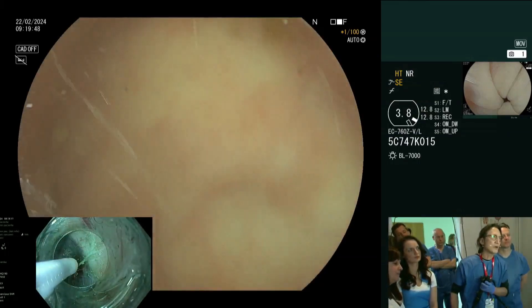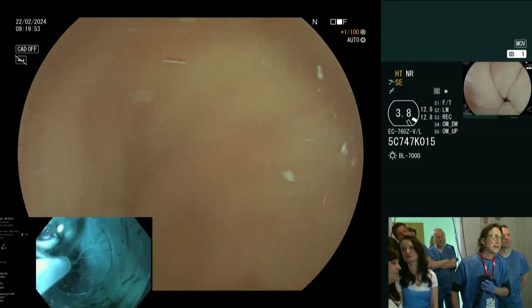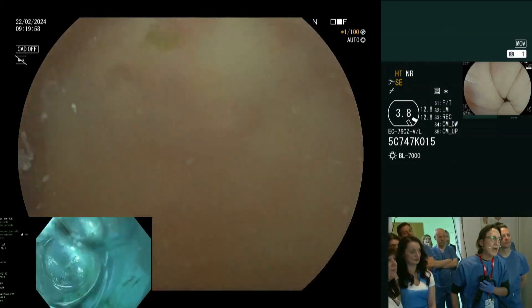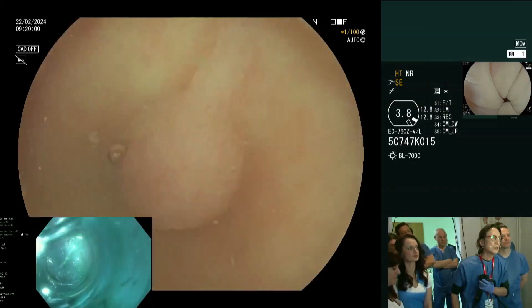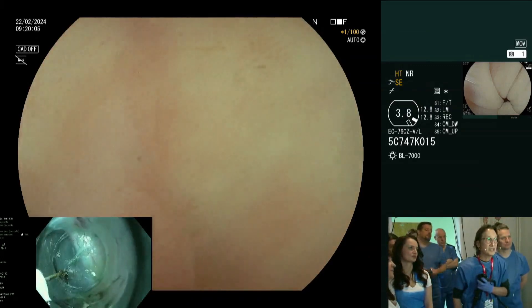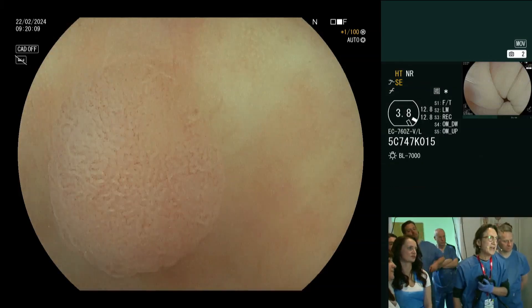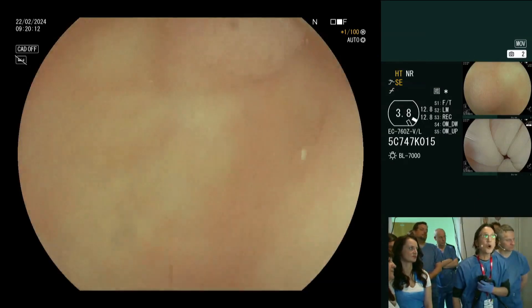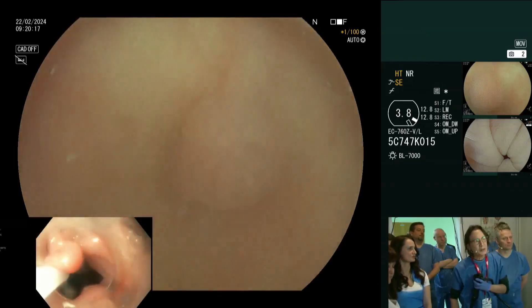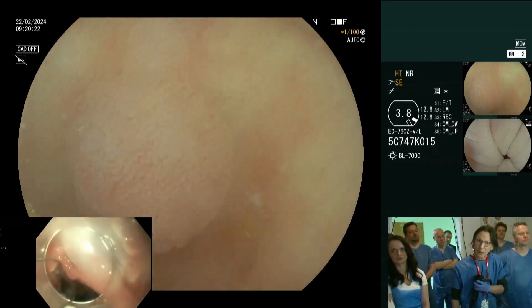I think there was a polyp here that was missed previously. The technique is to circle around the lumen like this — and there's the polyp. See how it kind of floats here? This is an adenoma; you can see the pit pattern is very typical of an adenoma. This is something you would cold snare. We can do that afterwards, but I want to focus on the main lesion. For small lesions less than one centimeter, I cold snare, and I do that underwater as well.